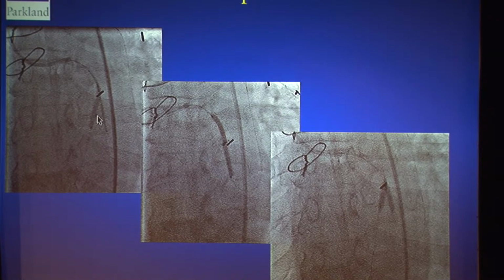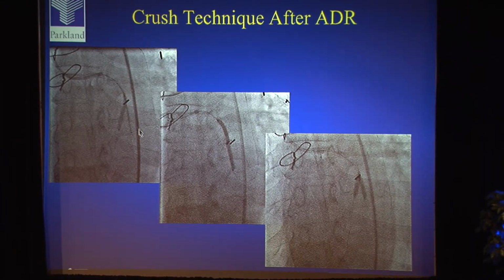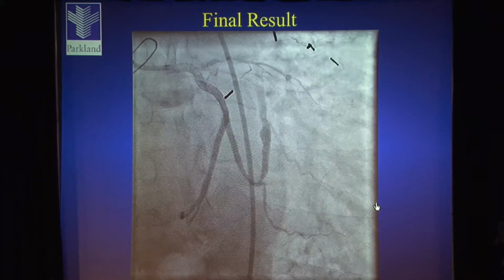There's a side branch stent that's inflated into the proximal circumflex with our main branch uninflated stent in place. Our wire and stent balloon is removed from the side branch, which I consider the AV groove circumflex, and the main branch stent is then deployed, and then we do kissing balloon inflations. And this is our final result. This after stenting all the way to the left main.